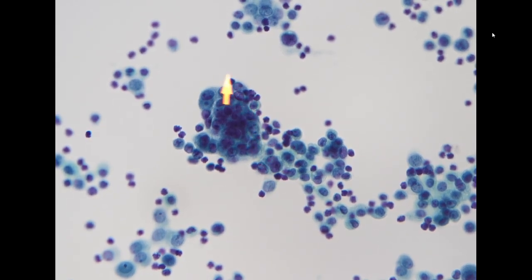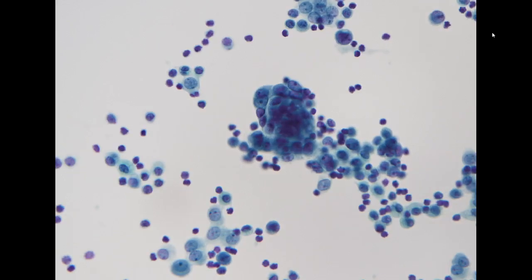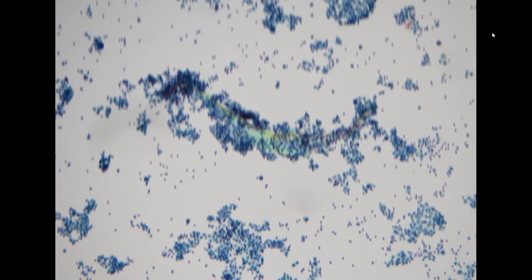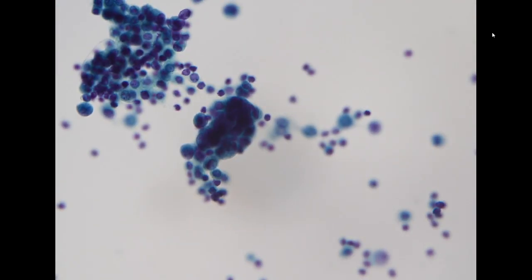I think the major issue is that it is very three-dimensional. And here we do see occasionally some cells show a prominent nucleolus. So the three-dimensionality is not good. You need to check if there is any issue. Here we see more atypia. Here we do see an atypical cell, but it has a necrotic nucleus. So it looks like the patient has metastatic adenocarcinoma, but due to the preparation, it's a little bit difficult to appreciate the morphology.